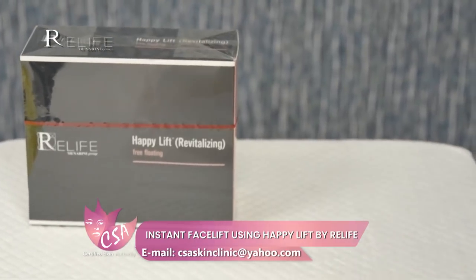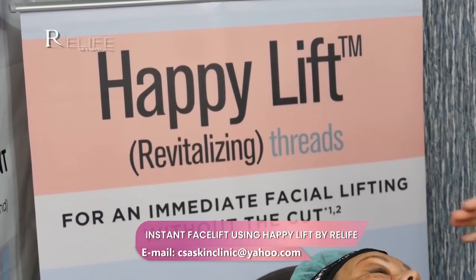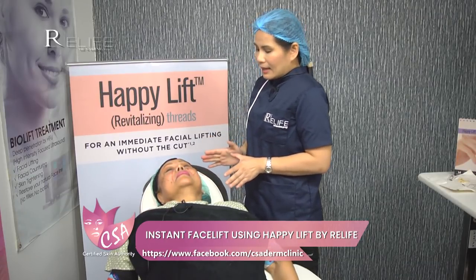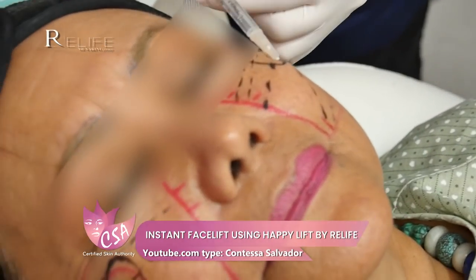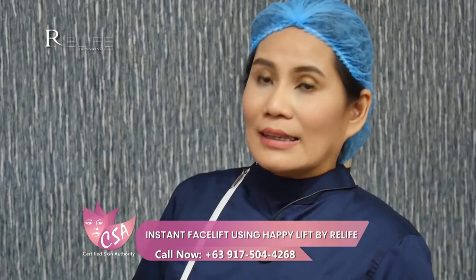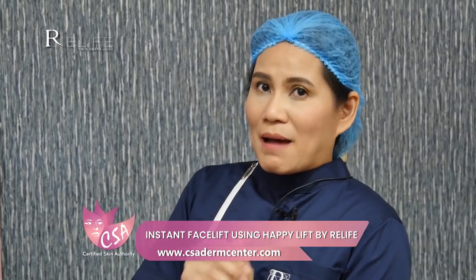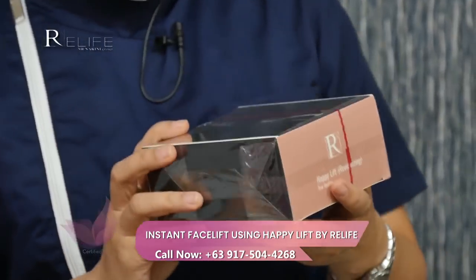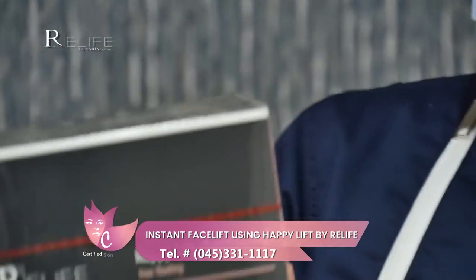We have the Happy Lift revitalizing threads for an immediate facial lifting without a cut. It's important to do the surface landmarkings first, and then anesthetize the skin. We have injected lidocaine intradermally because that is the site where we will be placing our threads. The threads will be positioned in the supra-SMAS or subdermis layer. We're using the Happy Lift free-floating threads — here is a box of the Relife Happy Lift revitalizing free-floating threads.